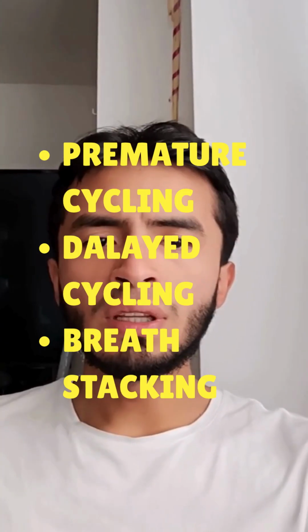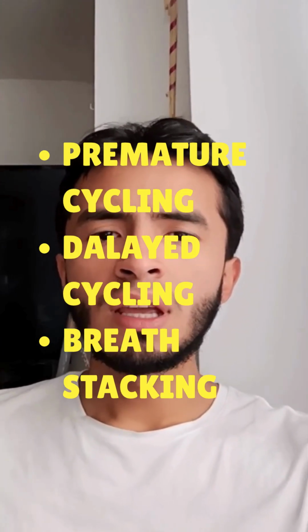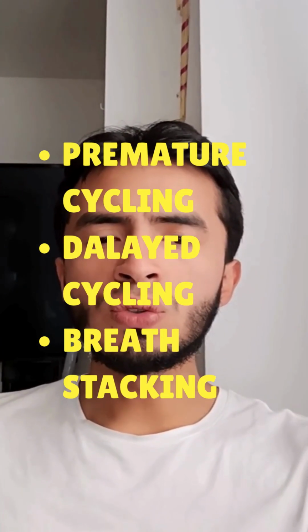Now I will explain double triggering. Double triggering is a type of triggering asynchrony. It happens when two consecutive breaths occur with little or no expiration between them.